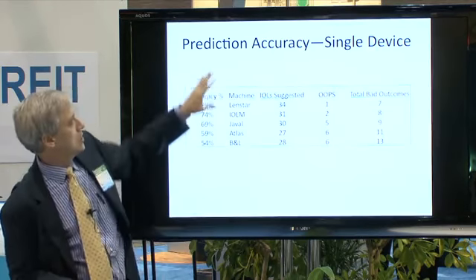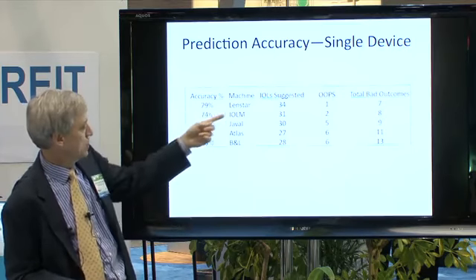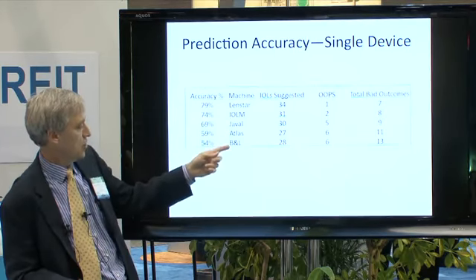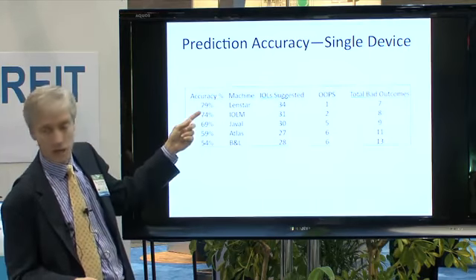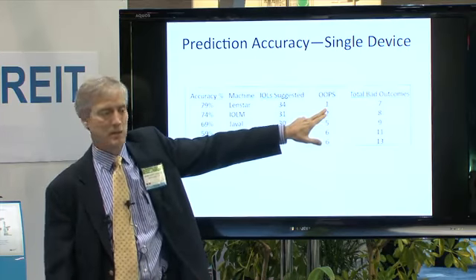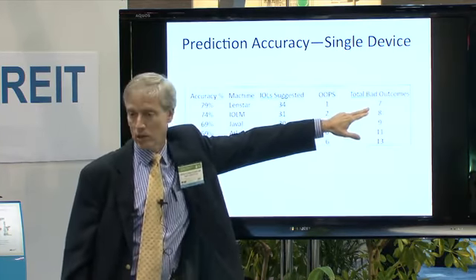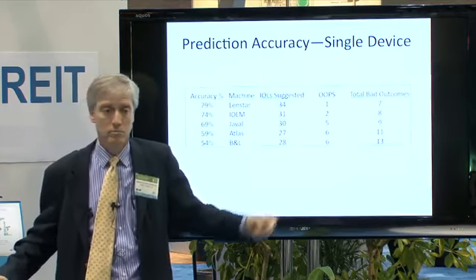How did we do? If you take the single device as is, how did the Lenstar do compared to the IOL-Master, the Javal, the Atlas, and the Bausch & Lomb? Took the numbers from each of these. The prediction accuracy was 79% on the Lenstar. There was one oops. I'm not excited about that. There were 7 bad outcomes. It chose more lenses than any of the others.